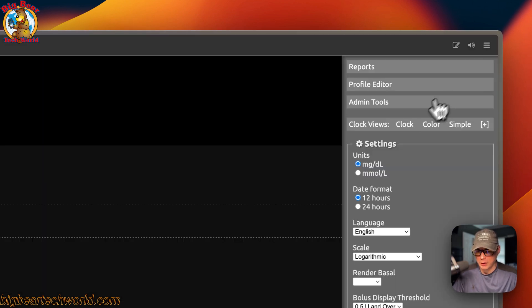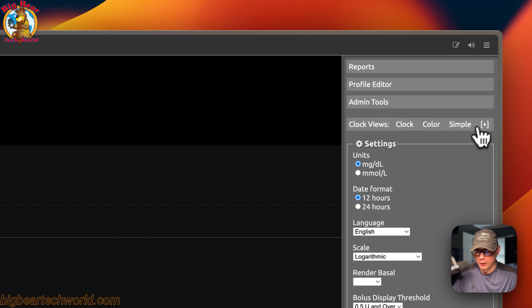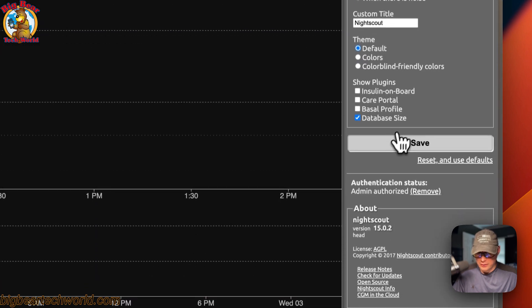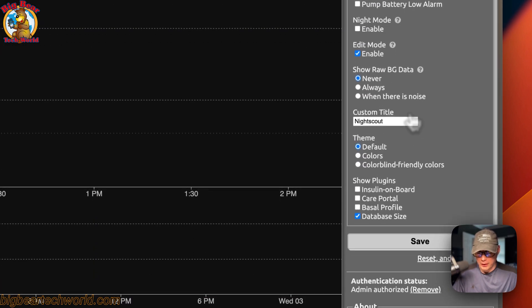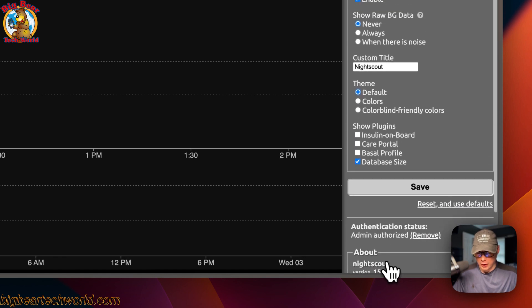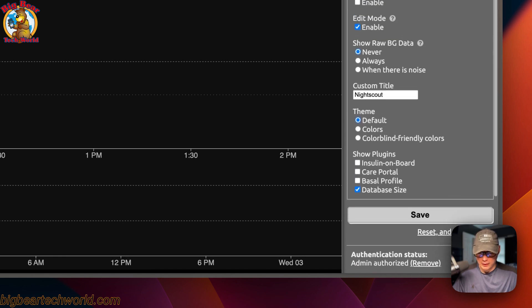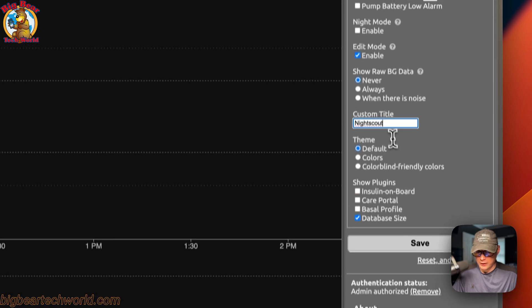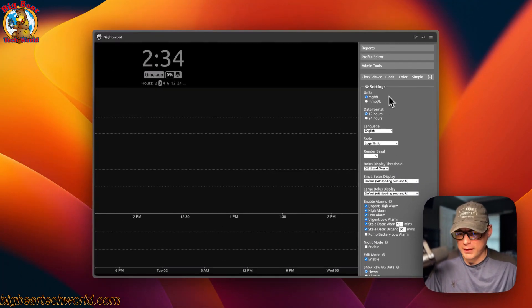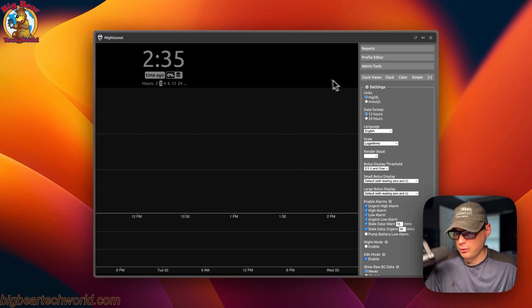You can also come down to Clock Views — Clock, Color, and Simple — and the Settings section where you can save. You can see the authentication status, reset to defaults, and change the title. That's a brief overview of the Nightscout UI.